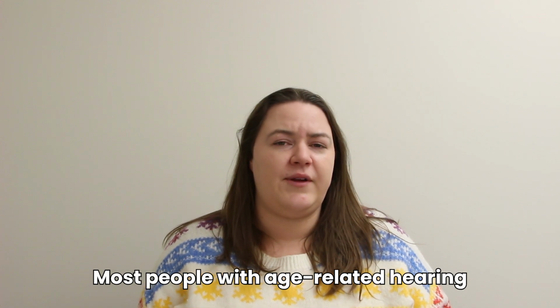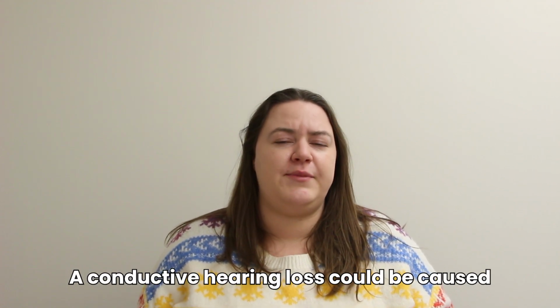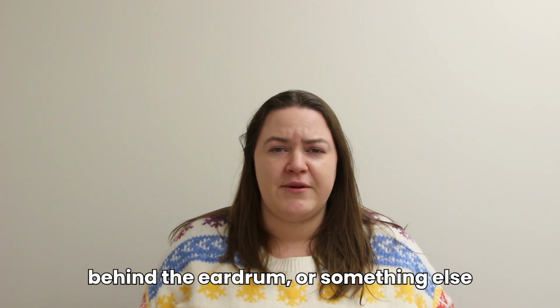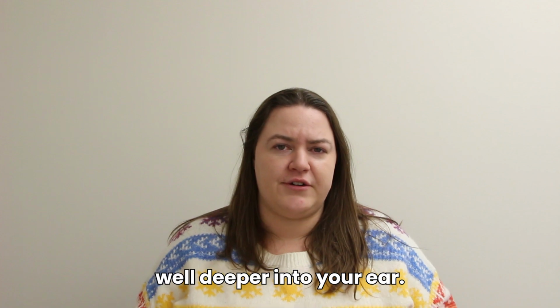Most people with age-related hearing loss or noise exposure will have a sensory neural hearing loss. A conductive hearing loss could be caused by too much wax in your ear, fluid behind the eardrum, or something else that's causing sound not to transfer well deeper into your ear.